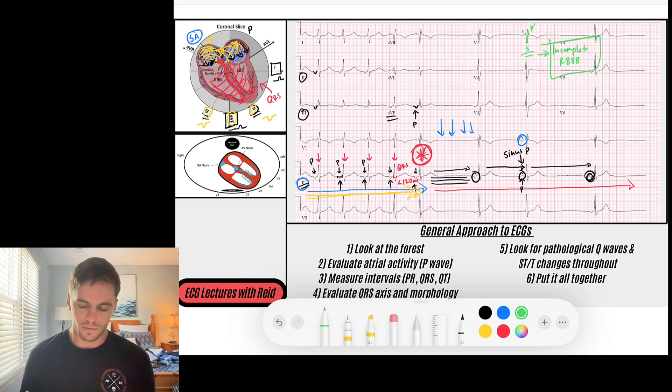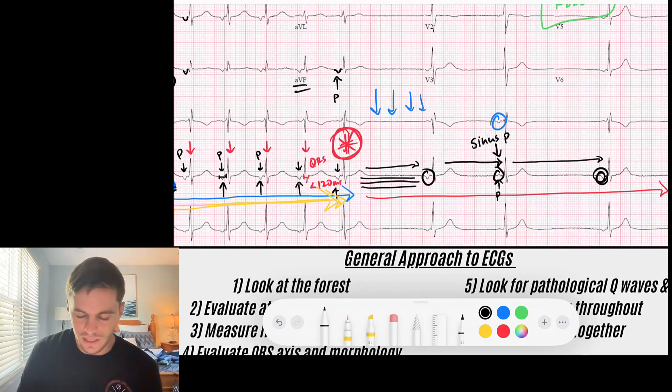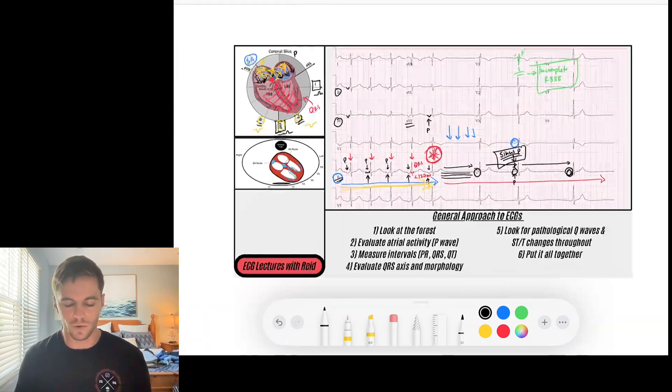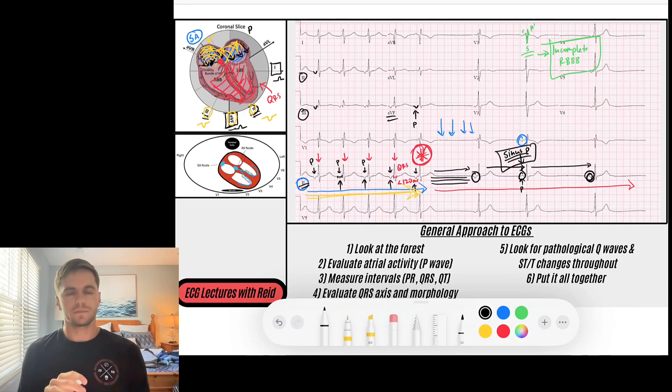And so what do we get here? We have an ectopic atrial rhythm that then breaks with evidence of what I would almost say is a sick sinus syndrome where we only really get one sinus P wave. So moral of the story: every single rhythm that you see, you need to evaluate the morphology of those P waves and make sure you understand exactly where they're coming from.